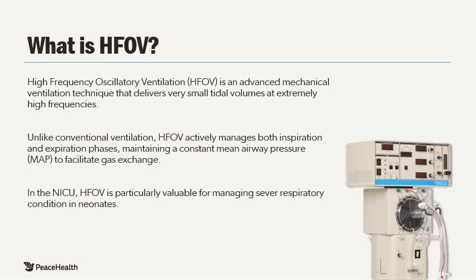High-frequency oscillatory ventilation, or HFOV, is an advanced mechanical ventilation technique that delivers very small tidal volumes at extremely high frequencies, typically from 3 to 15 Hertz, which equates to 180 to 900 breaths per minute. Unlike conventional ventilation, high-frequency ventilation actively manages both inspiration and expiration phases, maintaining a constant mean airway pressure to facilitate gas exchange through mechanisms such as diffusion and convection.